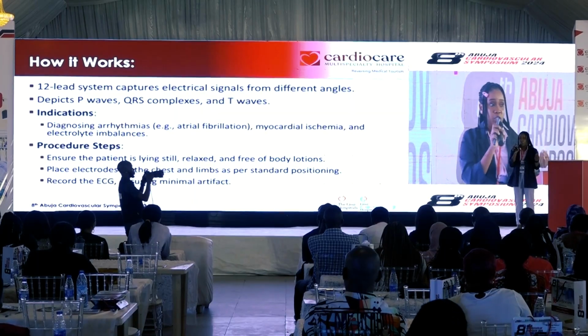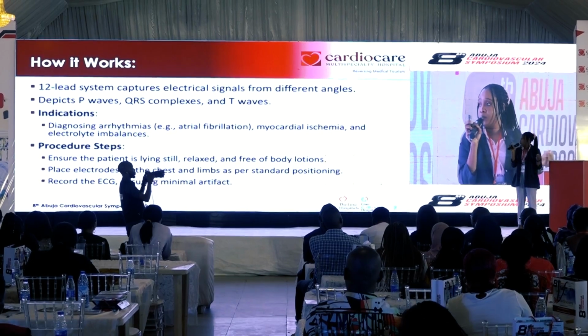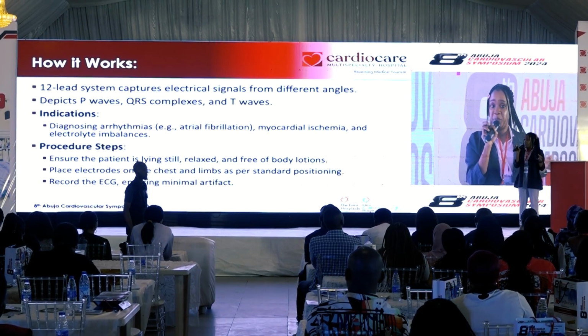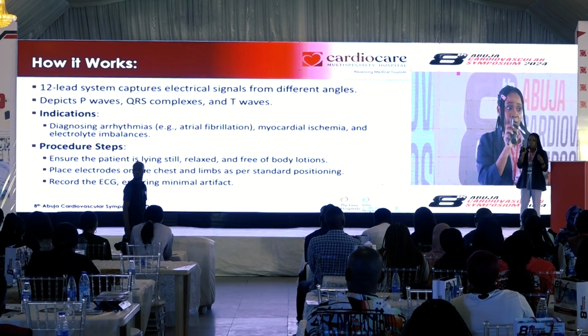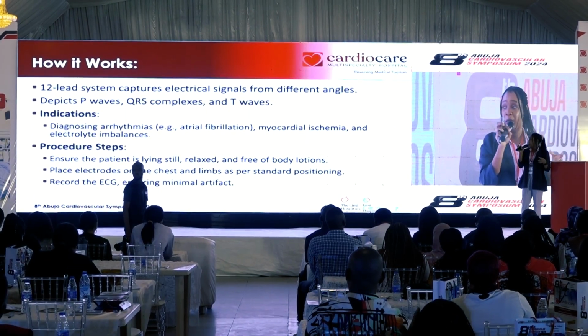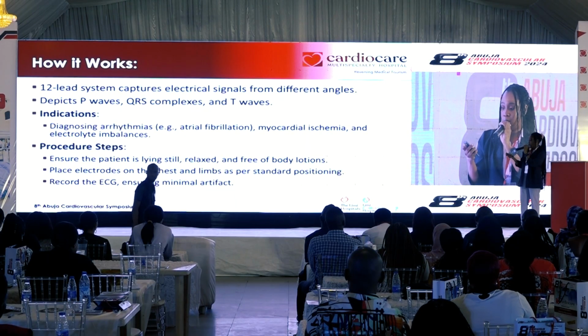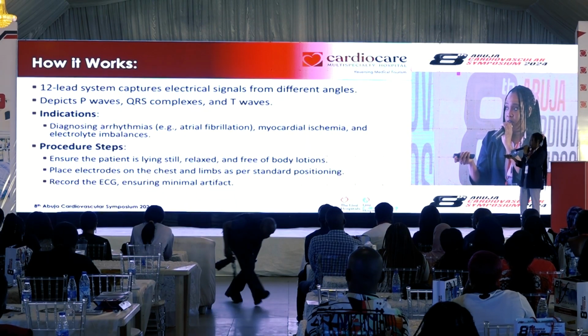And then we clean the chest. For those who must have used lotion, we try to use spirit and cotton swabs to clean it. Believe me, it helps to reduce the artifacts. Sometimes you'll see some type of artifact that might make reporting this ECG very difficult. Just try that method and you'll see that it helps minimize artifacts.